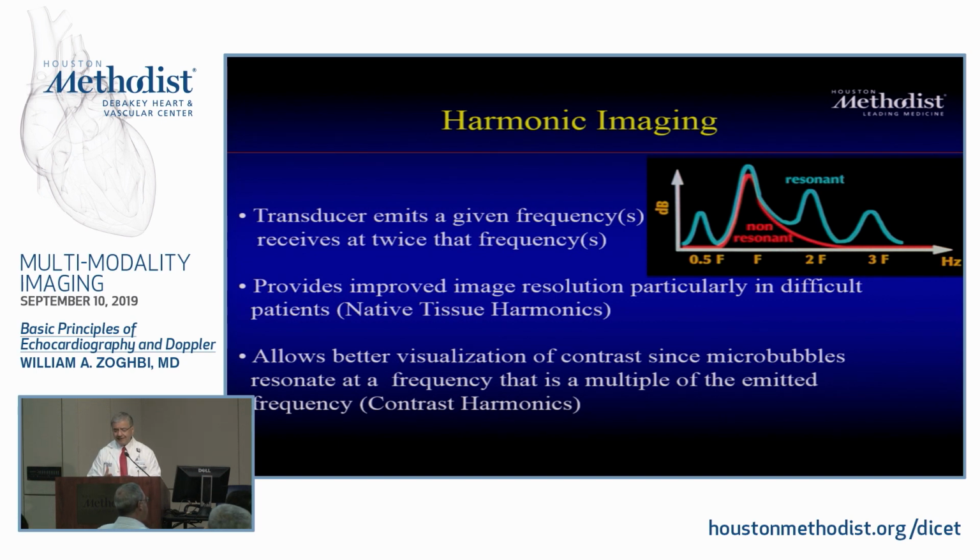All right, so you take advantage of this. And the interesting thing is when people used this frequency to look at tissue, interestingly enough, tissue was also emitting harmonics, not only the fundamental, and it had one beautiful thing, which is it decreases the noise, decreases some of these reflections that you've seen, particularly in the apical region. And that's the beauty of it.